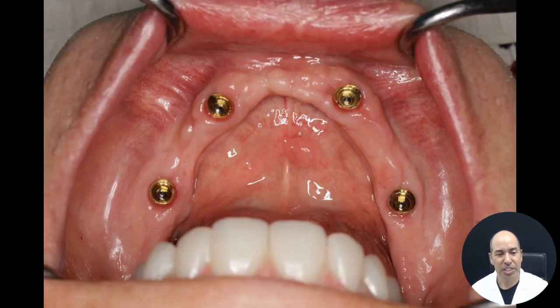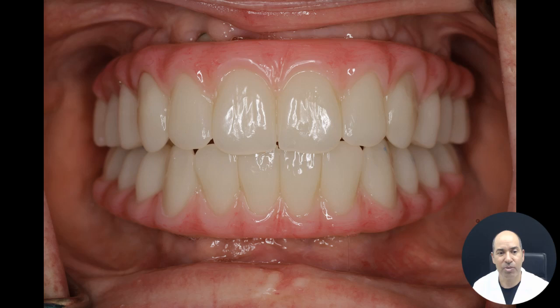But what I wanted to change on her was she needed a little more upper teeth to show. She needed her smile to be wider. Even though her jaw was really narrow, her face really kind of had these dark spots we call the buccal corridor. So I wanted to fill that out. So what I did is took a bunch of pictures with her with the original. So even though you may think this is very nice, maybe don't, but I'm going to make her a second set of prototypes because I want it to be better and she would like some changes as well.